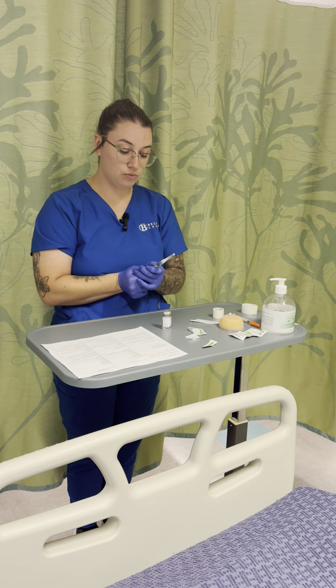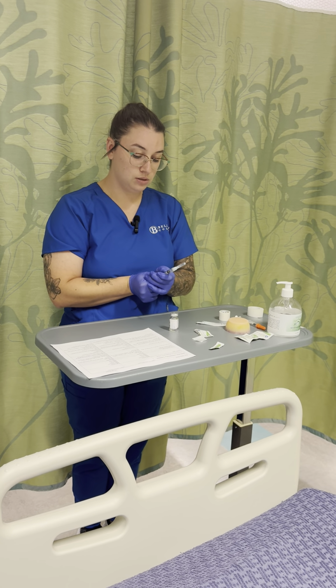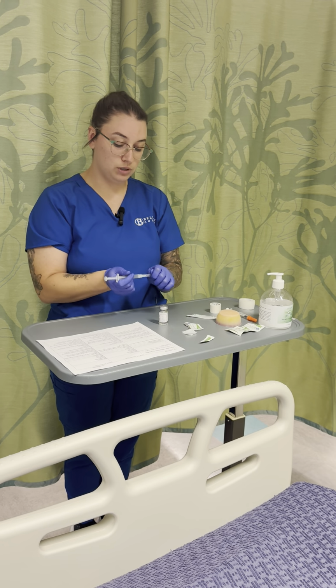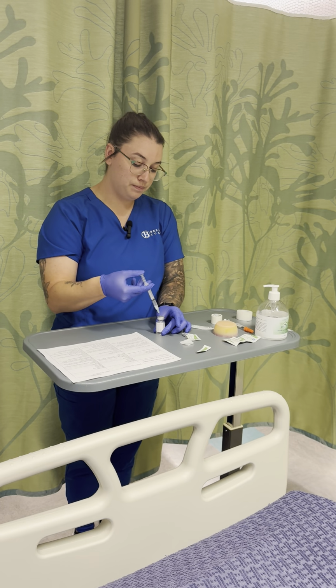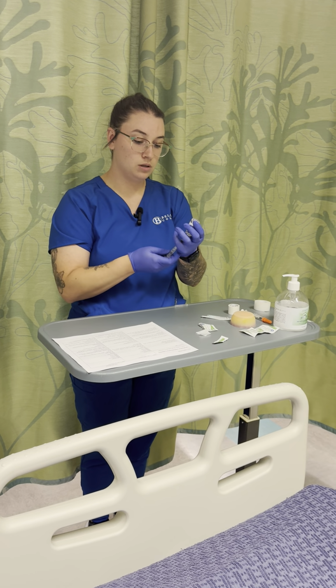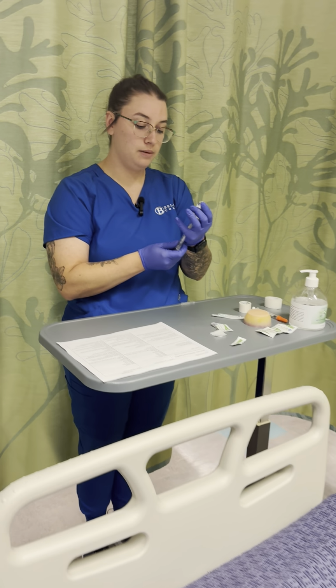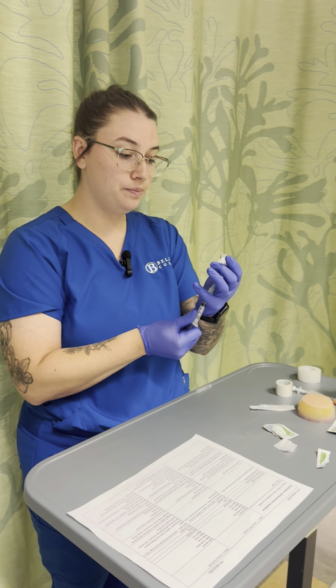Pulling 1.3 of air into my syringe. I will insert air into the vial, and then I'm going to pull 1.3. I'll make sure I'm pulling slow.